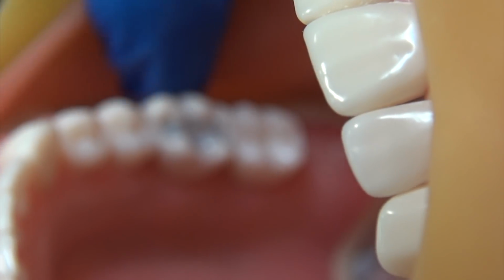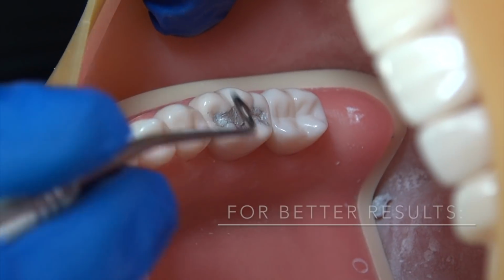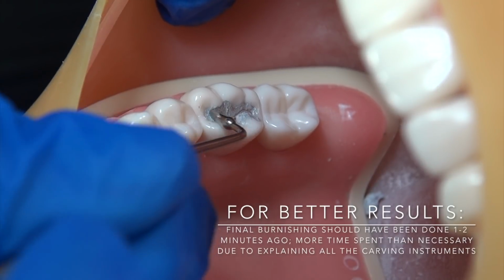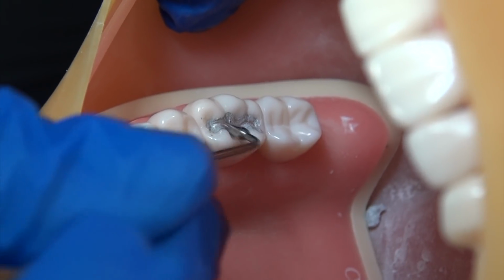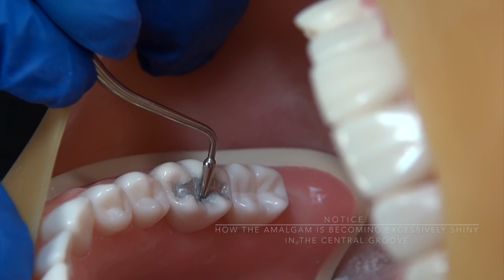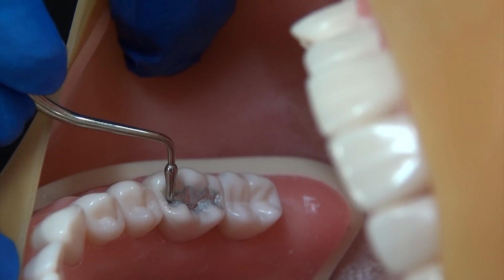Okay, so I'm pretty much done. Everything's pretty set up. Now I'm just going to go back through one more time and run my burnisher through. Now I'm starting to get it really smooth, really shiny. So I'm already getting to that point where it's time to stop messing with it. And see how I'm going pretty fast? You want to go pretty fast using a light amount of pressure, not too terribly much. And see, every time I go into a groove, I really accentuate it, really go through. See, a lot of back and forth motion.